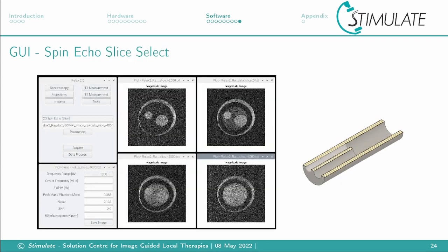Here you see slice selective spin echo imaging on a small blood vessel-like sample. It goes from one bigger diameter to two smaller diameters.